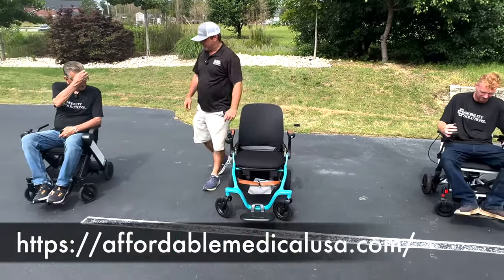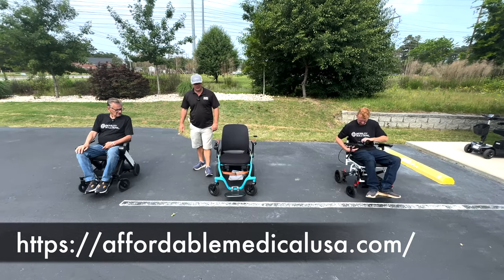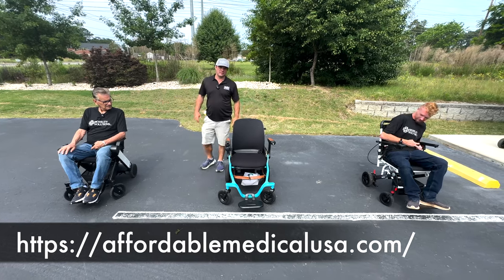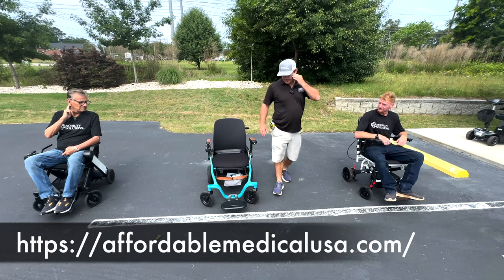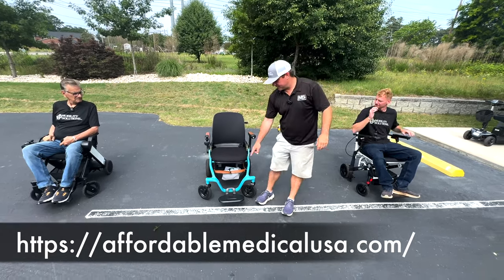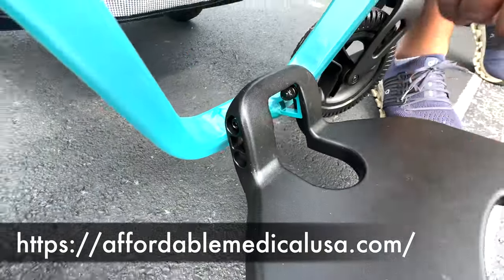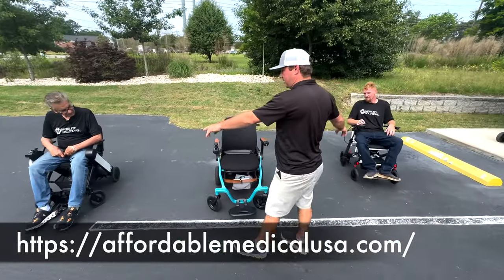This one comes with a seat belt. That one comes with a seat belt. That one you'll probably have to add the seat belt. Price-wise, they're all similar in pricing. This one's probably gonna be a tiny bit cheaper. Very similar. Oh, this is adjustable in height. You have three adjustments. And the foot plate, these can't be.